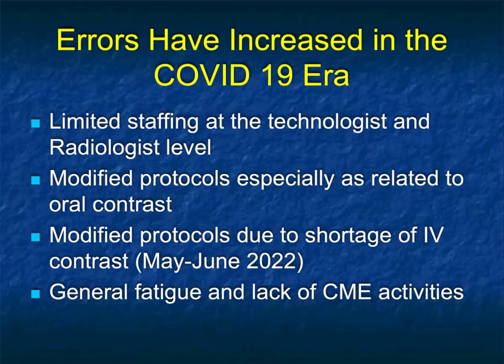We've modified protocols in the COVID era. First, we were afraid to take masks off. Then we have contrast shortages, all sorts of issues. And also, there's just a general fatigue.